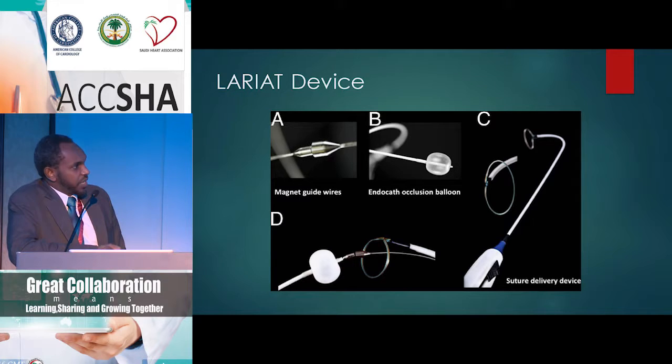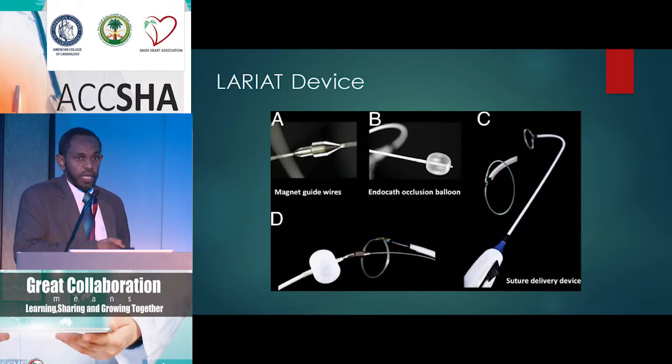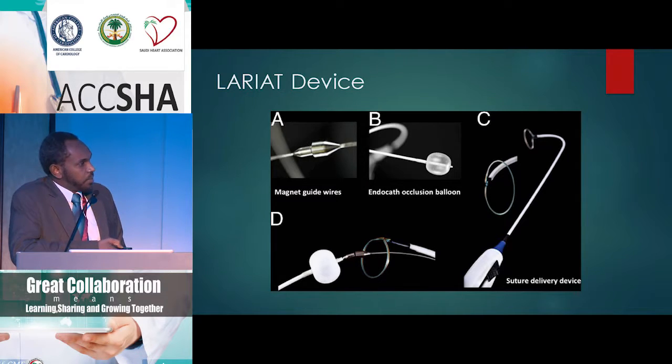This device was actually FDA approved and CE marked for suture delivery. It's a suture delivery device. It was not really FDA approved for LAA occlusion, and it was never really studied for that reason. So basically the studies that are available right now are registries and retrospective studies, in patients who are not amenable to using Coumadin or anticoagulation.